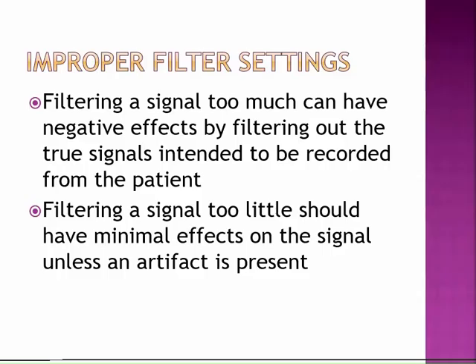You want to just leave them alone, because if you play around with filters just to make it look pretty the way you think it should look, you can really impact the integrity of the recording, especially if you don't have a quality recording to begin with.